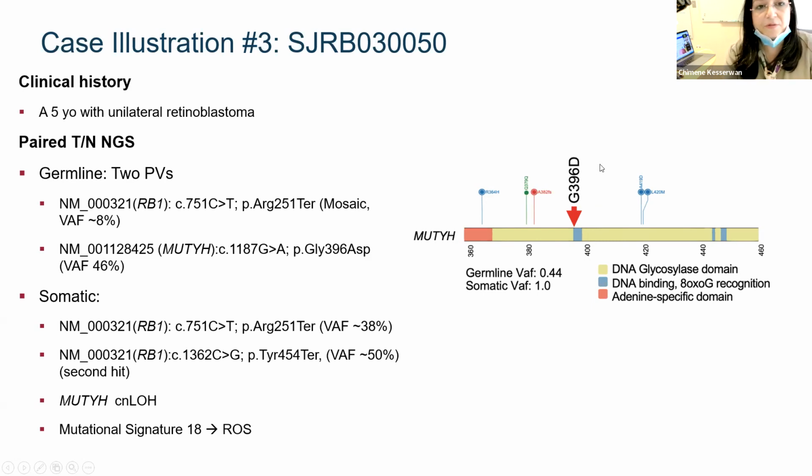So knowing that we are seeing this recurrent variant often when we do a comprehensive germline panel, we think it is incidental. The patient is a carrier rather than it contributing to the tumor.